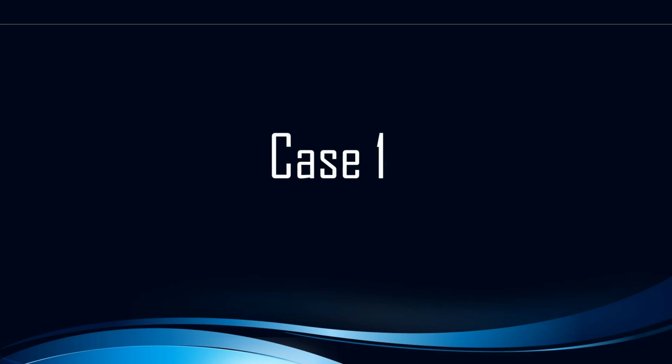Okay. As promised, we're going to go through these first 10 of 25 cases with demonstration slides for each step. And I'll try to make this brief. And just remember, you can always pause and go back or fast forward if I'm going too slowly. So case 1.